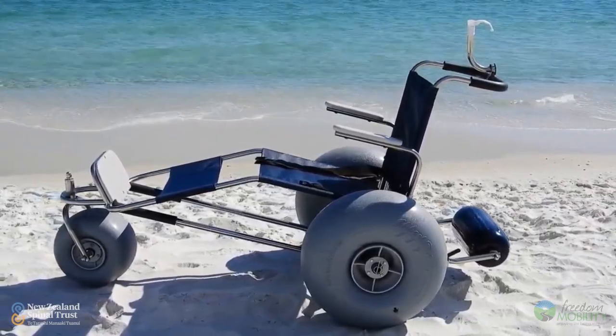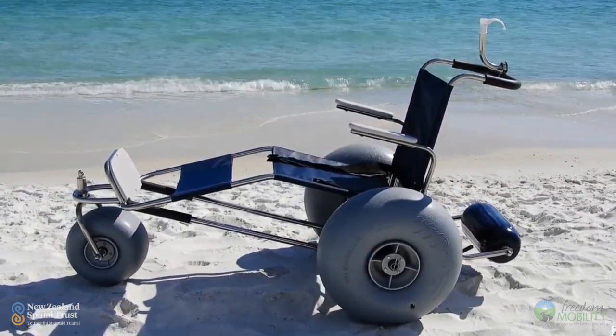It was quite a low chair and transferring down onto it was easy, but trying to transfer back up into my wheelchair was very difficult. It also had quite big balloon wheels that just floated in the surf, and it made getting on and off the chair in the surf very difficult.